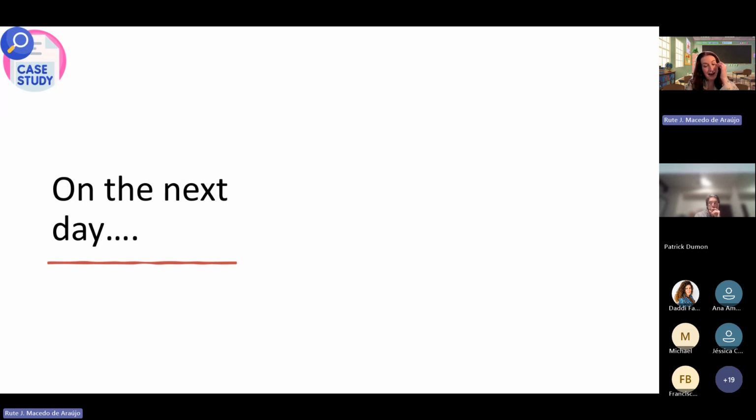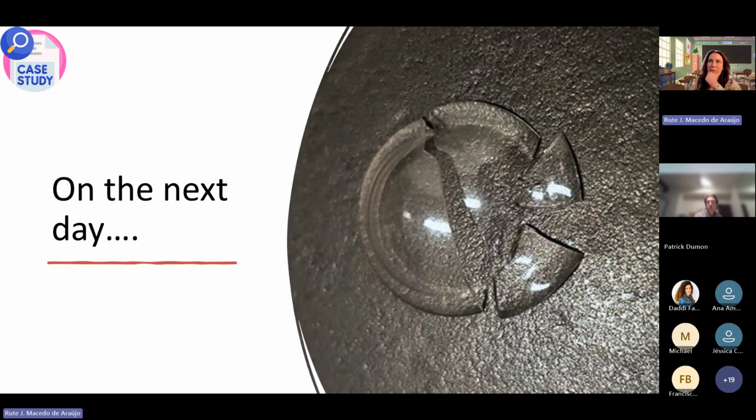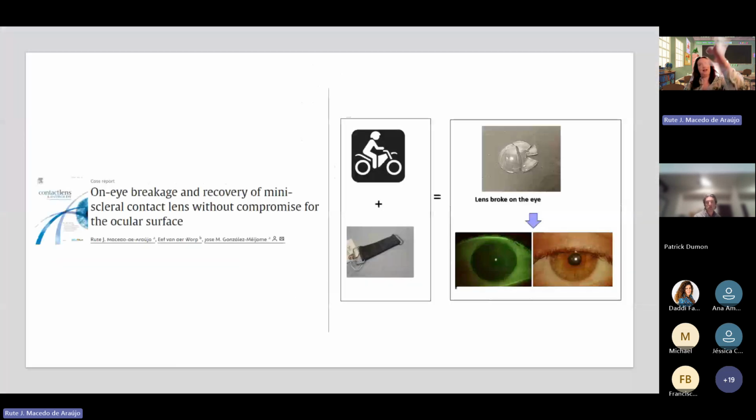is not ended, because on the next day, the patient was dispensed with the lens, was happy with the lens, and on the next day I received this photo. So the patient was with the lens on the eye. This case is documented here in this case report. So the patient was with the lens on the eye and doing some maintenance on the motorbike, and some piece got on the eye and broke the lens on the eye.